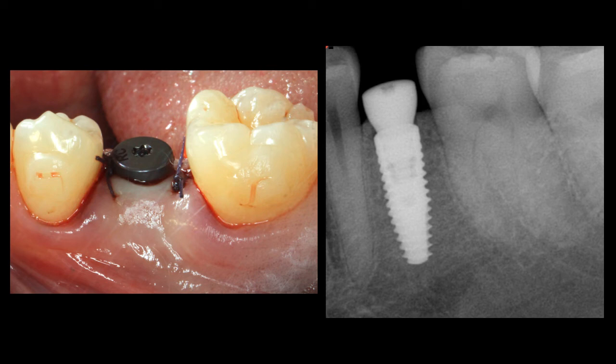I can appreciate the centralized location of this implant in this missing site of number 20. We can appreciate the slightly subcrestal positioning of the implant, and the radiograph has a little bit of a vertical tilt, so I know clinically that I'm only half a millimeter, not so much more than that. We don't need so much more than half a millimeter subcrestal in most situations.